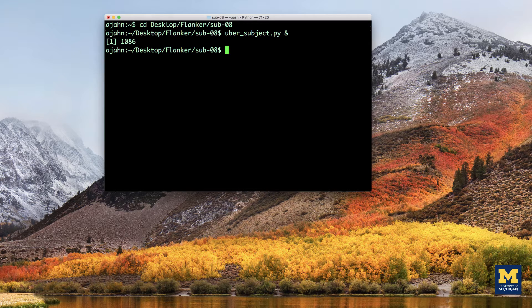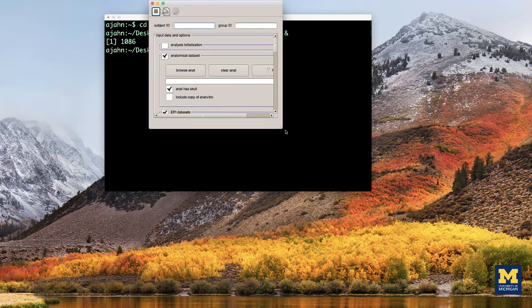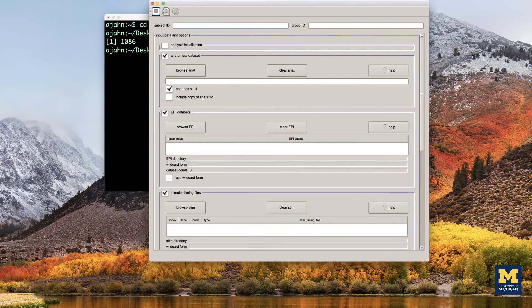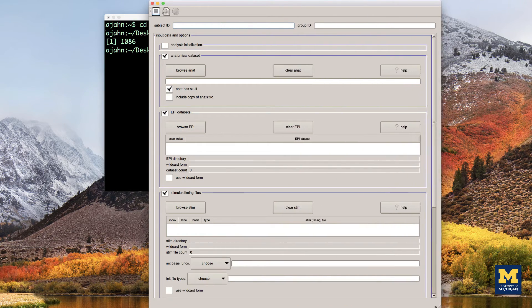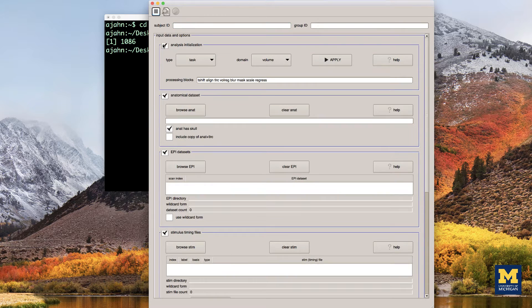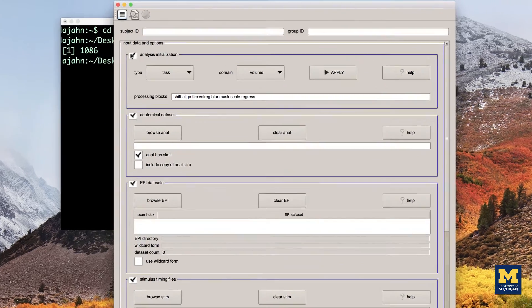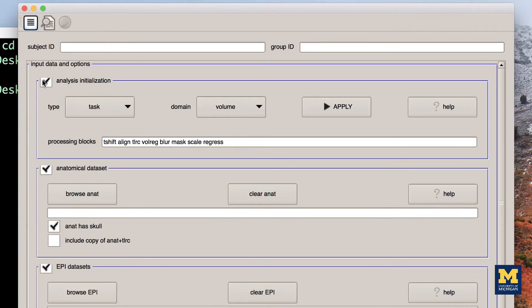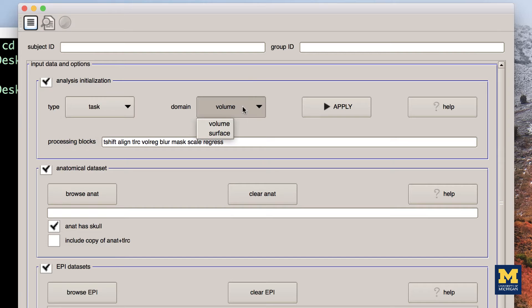For now, look at the first checkbox in the GUI, which is called Analysis Initialization. By default, the data analysis type will be Task, as opposed to Rest, when there's no task for the subject to do. And the domain is volume, as opposed to surface, which we will discuss in a later chapter on a program called SUMA.